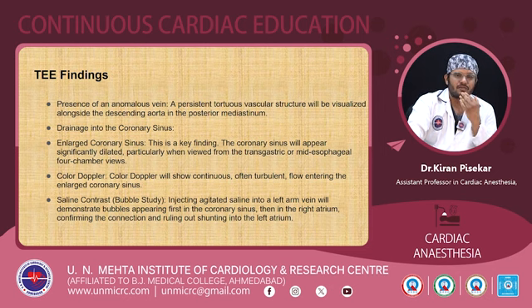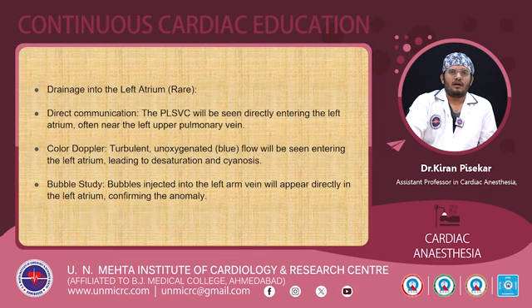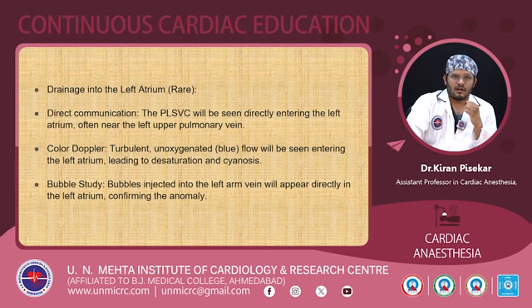And by using the saline contrast, if we have an IV cannula in the left forearm, then we can directly inject the IV fluid with microbubbles, and we can visualize if there are microbubbles coming into the coronary sinus. That means there is a left SVC opening into the coronary sinus. Again, it can drain into the left atrium as well, which we can visualize. It will be seen directly entering the left atrium, often near the left upper pulmonary vein. In color Doppler, we can see turbulent non-oxygenated flow entering the LA. We can use a bubble study as well.